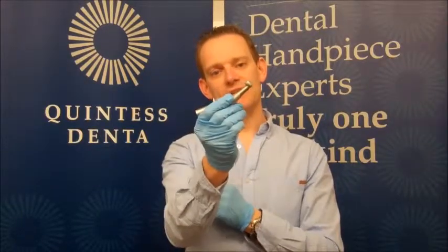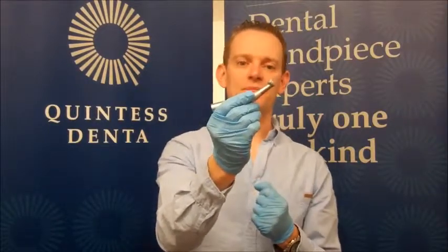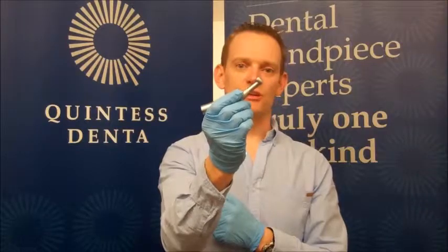So what about maintaining this? To ensure the longevity of the handpiece, we need to make sure that it's oiled correctly.